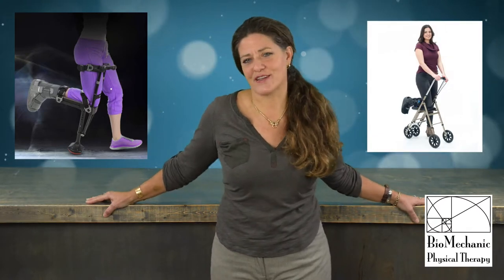We here at Biomechanic are trying a couple of alternatives to crutches: the iWalk and the Rollabout. Watch as our staff try to use them.